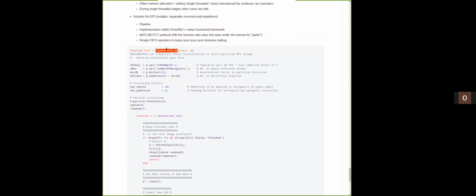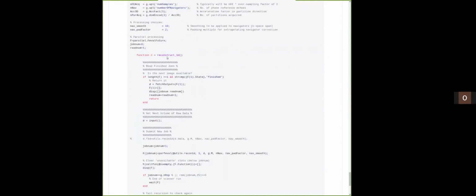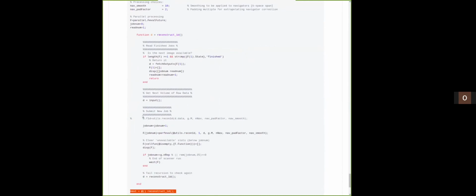So this is a step function. So it's our famous external function, which just returns a pointer to an internal function. And the internal function, without parallelization, would be something like this. It would just call our utility function to do the first Fourier transform, okay? That's commented out. Instead, what we're doing is there's no input being passed as the argument to the internal function. It's actually happening halfway through the function, okay?